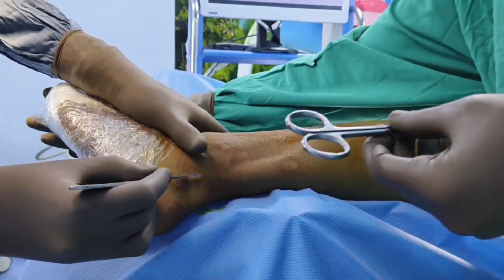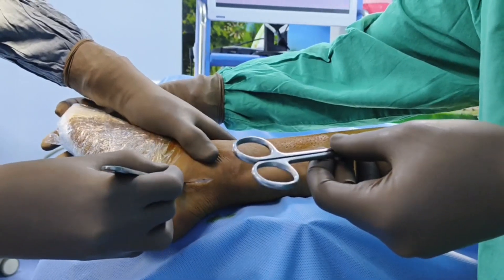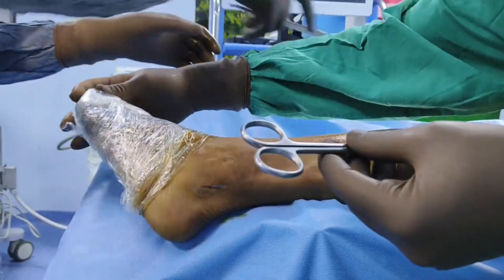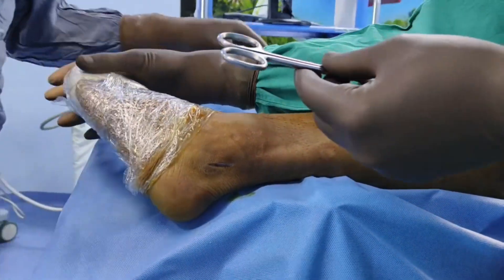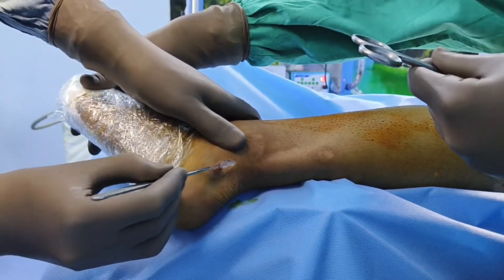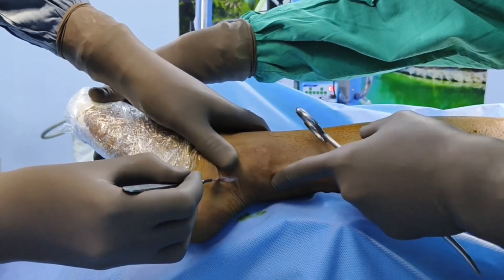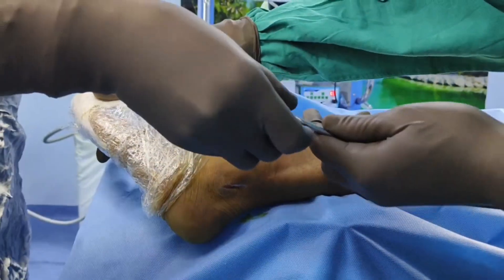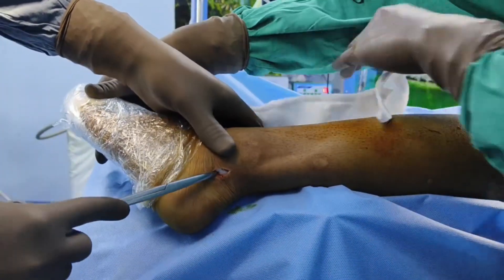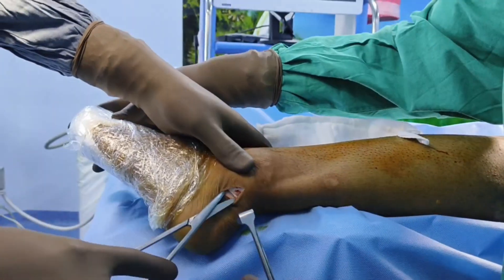After incising the skin, you have to dissect through the subcutaneous tissue, and then you will be able to see a white color structure. Be careful here — don't injure the short saphenous vein. When you see this white color structure, just dissect with the help of scissors or you can easily use the knife.